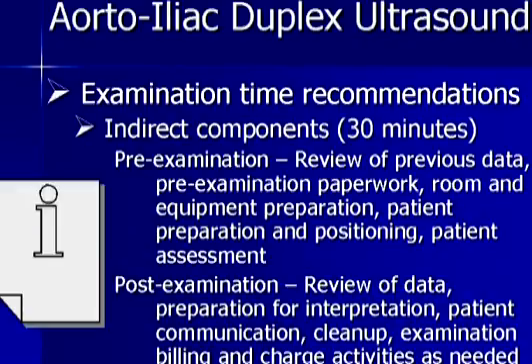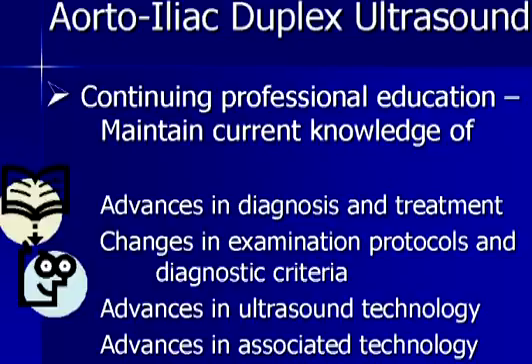The indirect components, the paperwork, the pre-examination assessment of previous data, review of records, patient preparation, positioning, patient assessment, and the post-examination preparation of all of your data and findings to present to the interpreting physician typically require about 30 minutes from this study. The math is not terribly difficult, and you can see this is a complex examination taking approximately 90 minutes on average for most patients, and possibly up to 2 hours in a difficult postoperative patient.